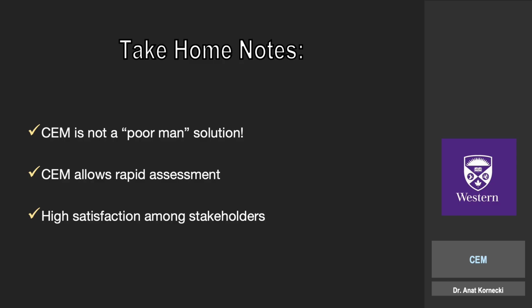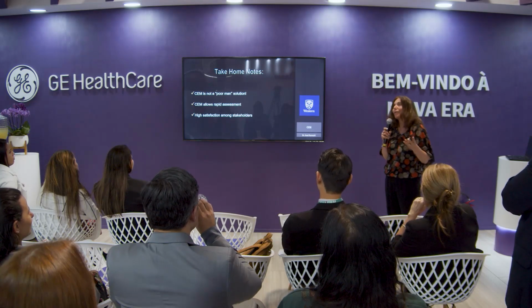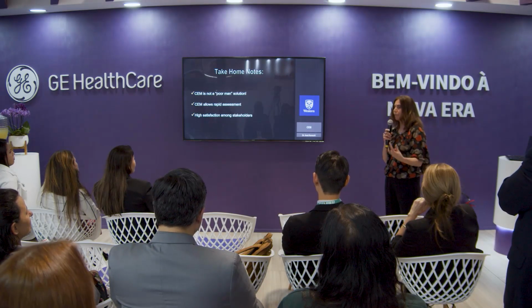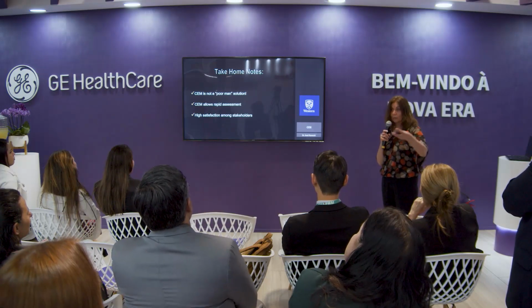Okay, take-home notes. Number one, and I think for me it's always important to emphasize, coming from my own perspective, that I used to say, I don't need contrast-enhanced mammography, I have MRI. Not true. You need contrast-enhanced mammography even if you have an MRI, because you don't have endless spots with MRI. Plus, there are other reasons, and this is the availability and the immediate treatment and diagnosis that you can offer the patient. You can save those spots to do something else with MRI, do more screening, more high-risk screening.